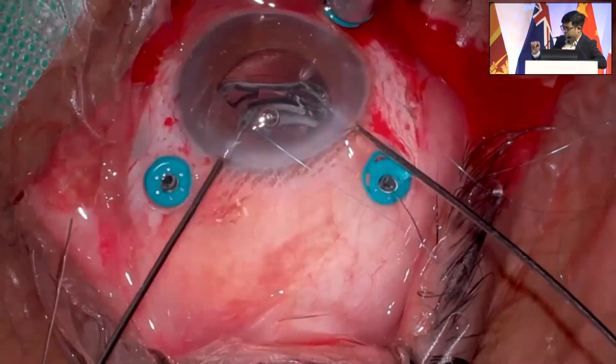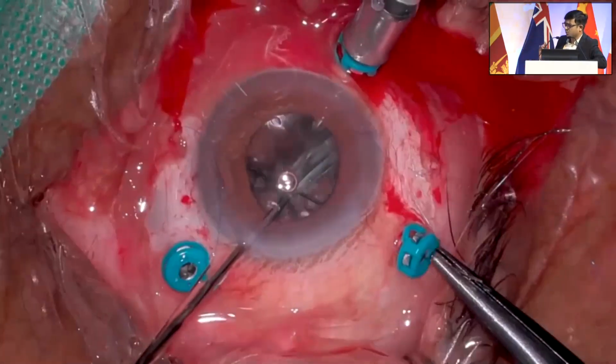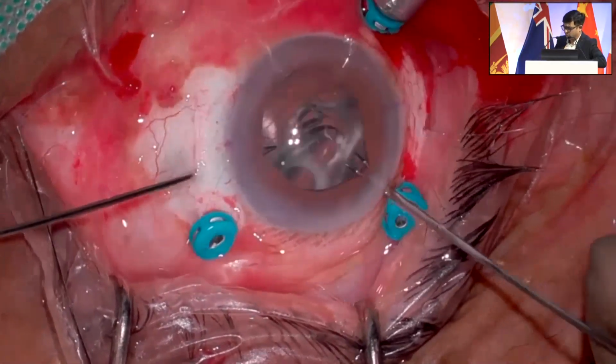And one more advantage of this technique: I have used a partial scleral groove, so post-op there is no visible 9-0 Prolene or that knot.